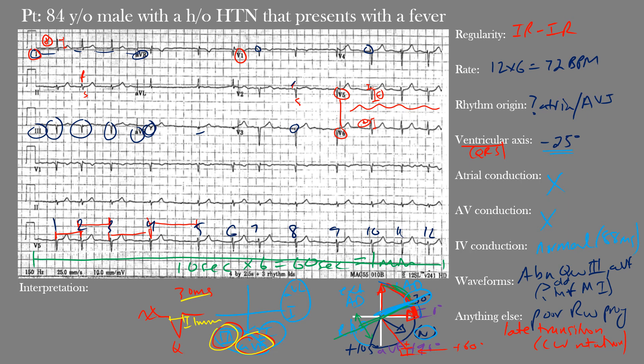Our final interpretation: we have an irregularly irregular rhythm at a normal rate with no clear or well-defined P waves, normal intraventricular conduction, and abnormal Q waves in leads III and AVF. This is a case of atrial fibrillation with evidence of a prior inferior MI. Note that atrial fibrillation is at a normal rate — 72 bpm — so there is no rapid ventricular response. The pathological Q waves in leads III and AVF represent the evidence of that prior inferior infarction. In conclusion, the 84-year-old male with hypertension presenting with fever has an EKG showing atrial fibrillation and evidence of a prior inferior infarction.